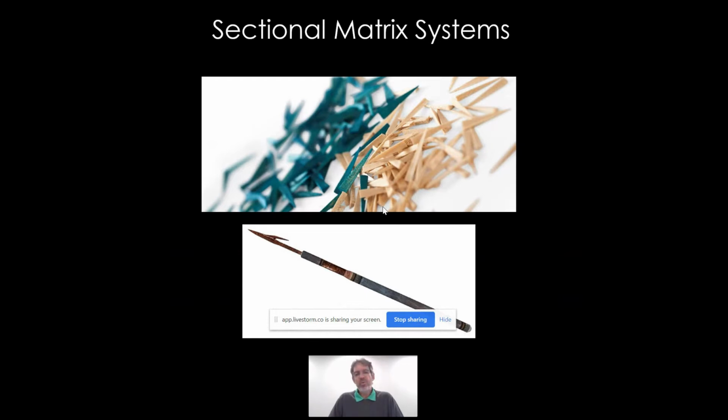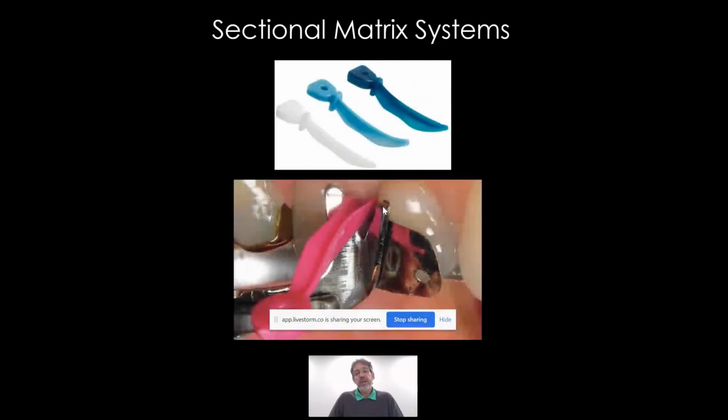So I kind of refer to wooden wedges as dental harpoons, if you will. Now, the other challenge with wooden and traditional plastic wedges is as you go up in size from small to large, the profile of that wedge gets larger as well. So certainly smooth plastic wedges were a step in the right direction. But the challenge with a traditional smooth plastic wedge is, again, they fill that space, they're not providing any separation force, they don't seal the matrix band well on the lingual aspect, and on occasion, sometimes they can back out of the embrasure area, which can be quite frustrating.